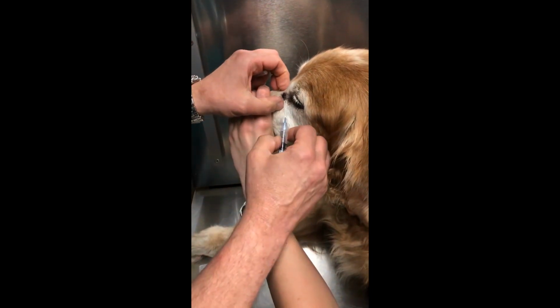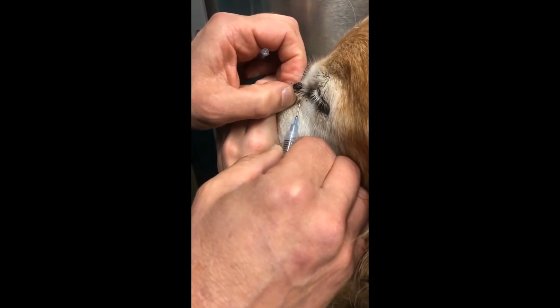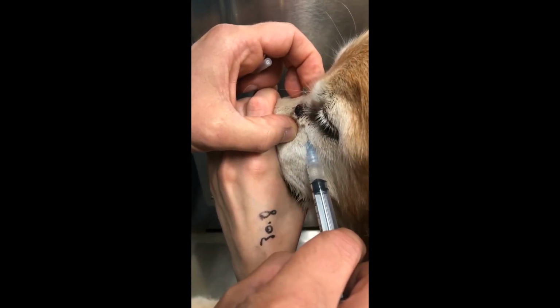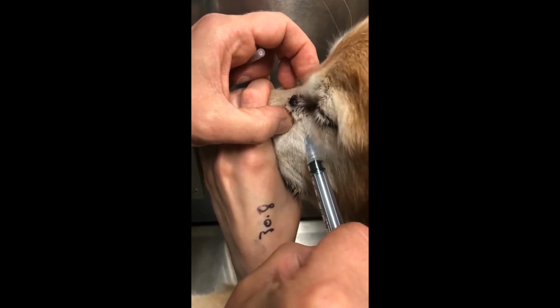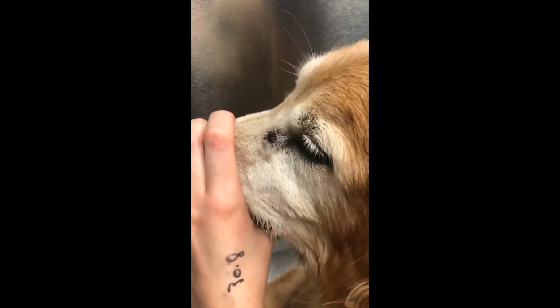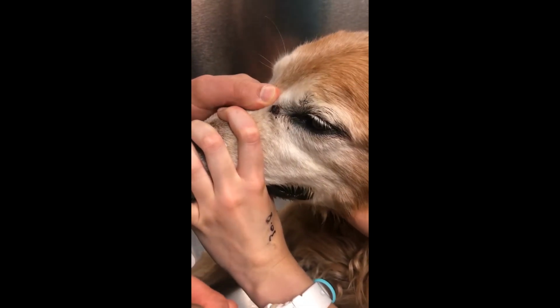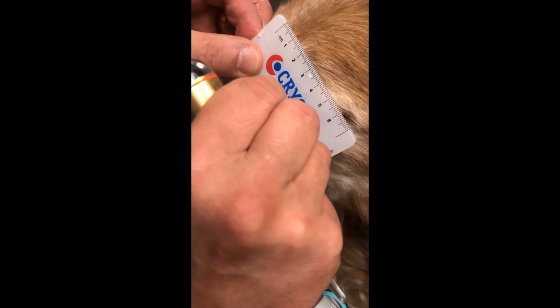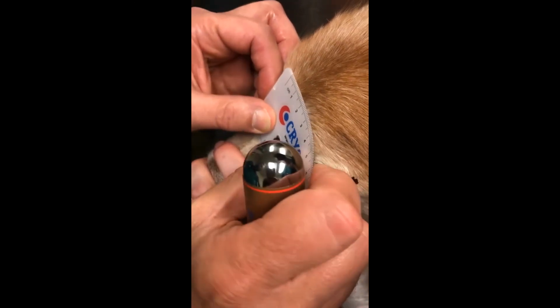So this is Lorenzo. He's a 12-year-old golden retriever. Lorenzo has a prior medical surgical history of having a right front P2 removed for digital melanoma. He is currently on melanoma vaccine, and he has this papillomatous lesion by his eye, which has repeatedly bled and caused distress to the eye. Due to the proximity to the eye, I have put a bleb of lidocaine subcutaneously, and I'm actually using the little measuring device to shield the eye.